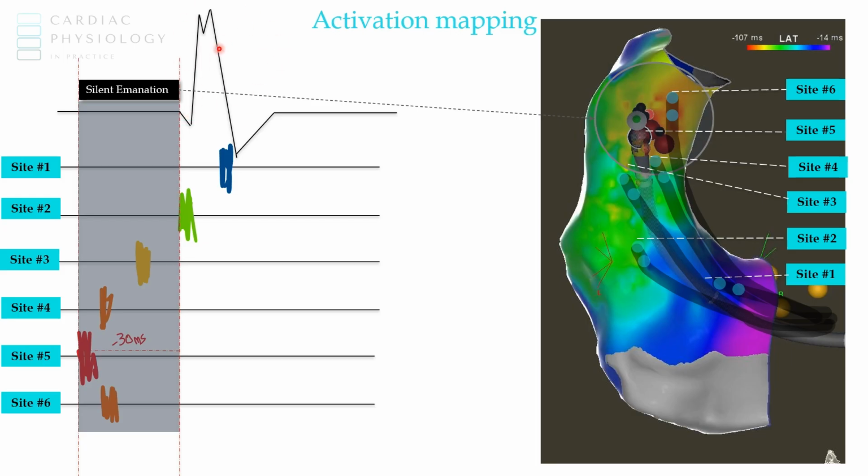If this is our QRS here, then you go, okay, well, my ablation catheter is quite late relative to QRS onset, and so I'm going to move my ablation catheter up to this location, and then now I detect an EGM that is occurring on time with QRS onset, so I know my ablation catheter is closer to tachycardia origin than my previous site of mapping, but it's still not 20 milliseconds ahead of the QRS onset. So I know I'm not quite at the tachycardia origin.